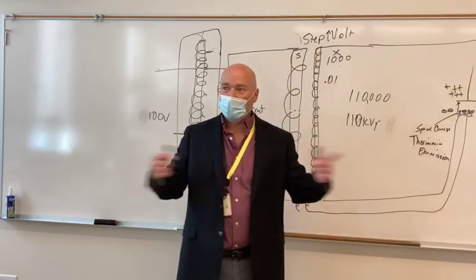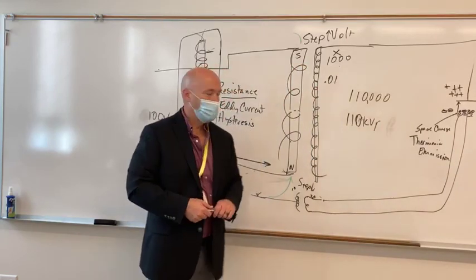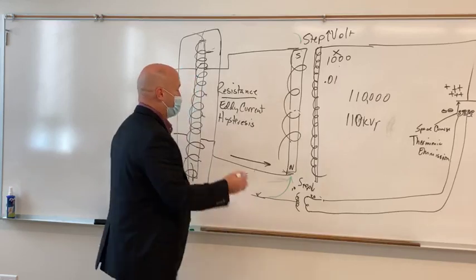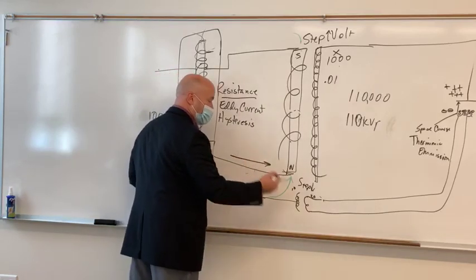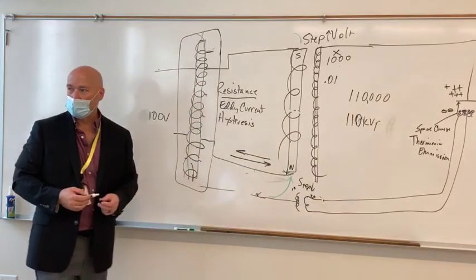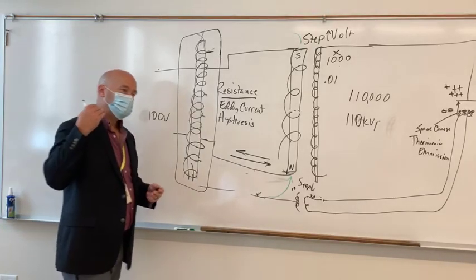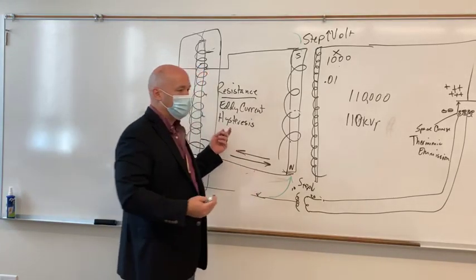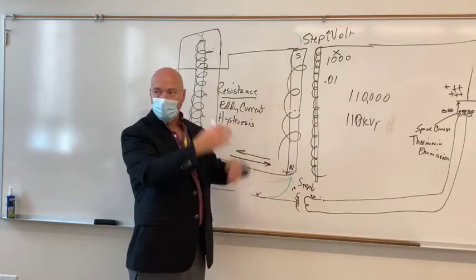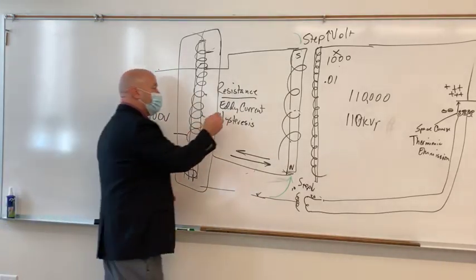So every time you change directions, are you going the same velocity at the beginning of each one of those? No. That's hysteresis, basically, an illustration of hysteresis. Since electrons are going in one direction, they got to slam on the brakes and go back in the opposite direction, you're going to have some loss. You're not going to have a constant 100% strong magnetic field at all times. It's going to increase, decrease, increase, decrease, even while it's flipping back and forth. Okay? So you got those three things. Those three things are still present.